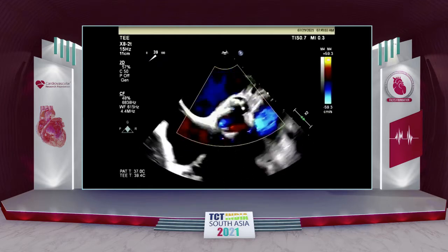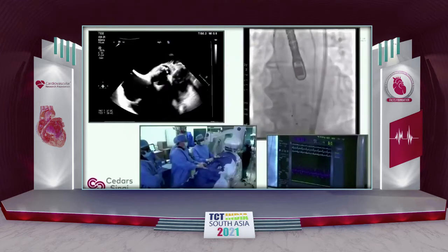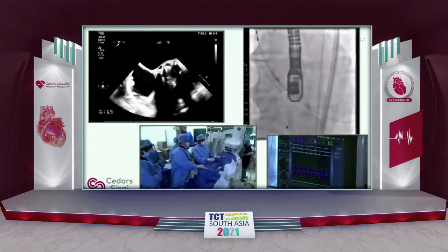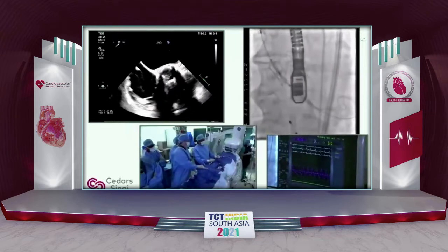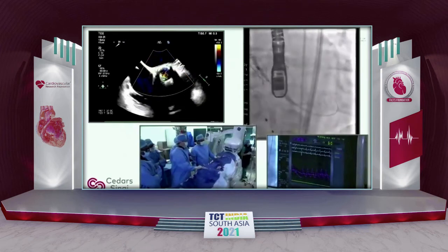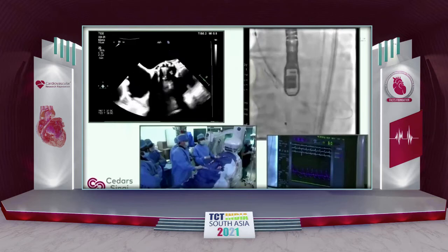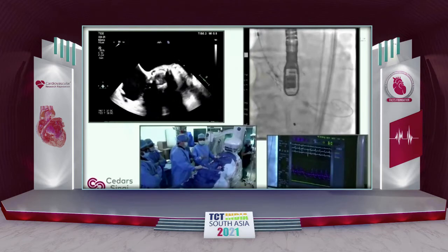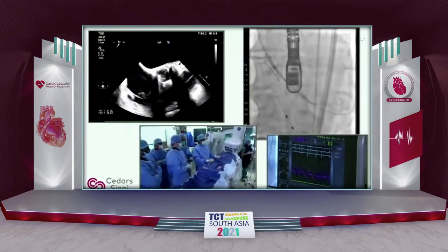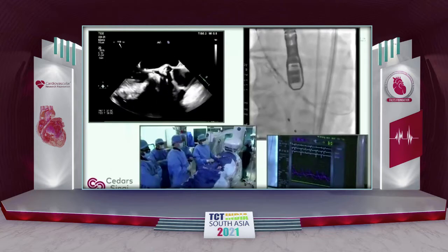Yeah. I didn't give an extra. So we may just go ahead and give a little bit more, maybe an extra CC, and see if we can make this better, because there seems to be a little bit of a gap there. I think we have to be careful here, because he's 80 years old, and mild AR is not going to affect his prognosis. He had baseline aortic regurgitation to begin with, so we don't want to cause aortic root injury. And of course, when you're doing TE, you will pick up these little jets. So let's go ahead and do one more.